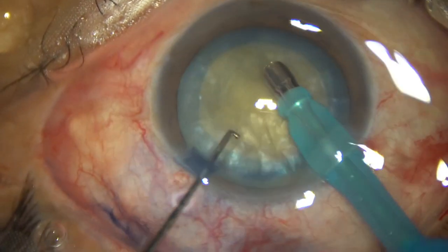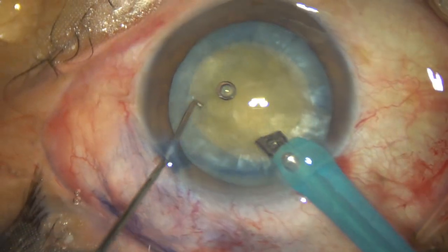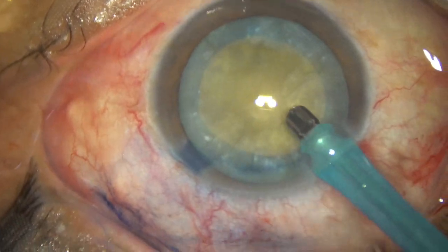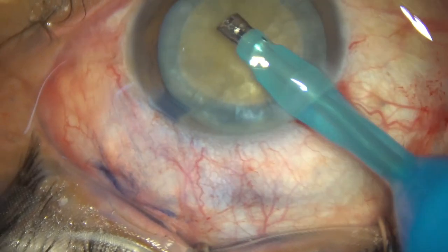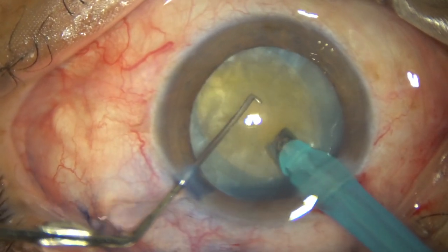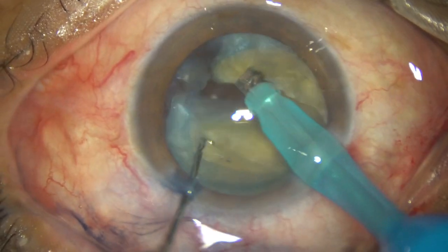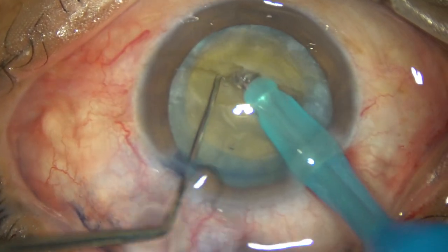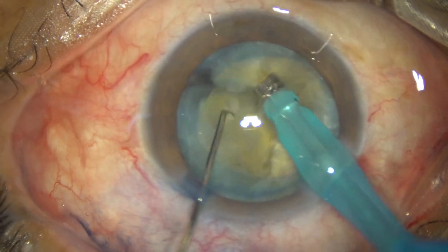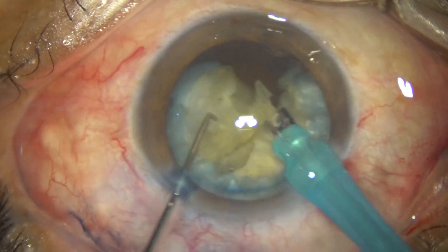And now, nucleus management. You can see that the nucleus is not soft; it is quite hard. Nucleus sclerosis is about grade 4. I am going to employ my technique which I call Submarine Jaw. The tip is buried into the substance of the nucleus just in front of the main incision. It goes through the substance of the nucleus towards the opposite equator, towards 5 o'clock. And this is a nice crack. 180-degree rotation and the two pieces are completely separated. In this technique, you don't have to make a trench — you can just go through the substance of the nucleus and divide it completely into two halves in most cases.